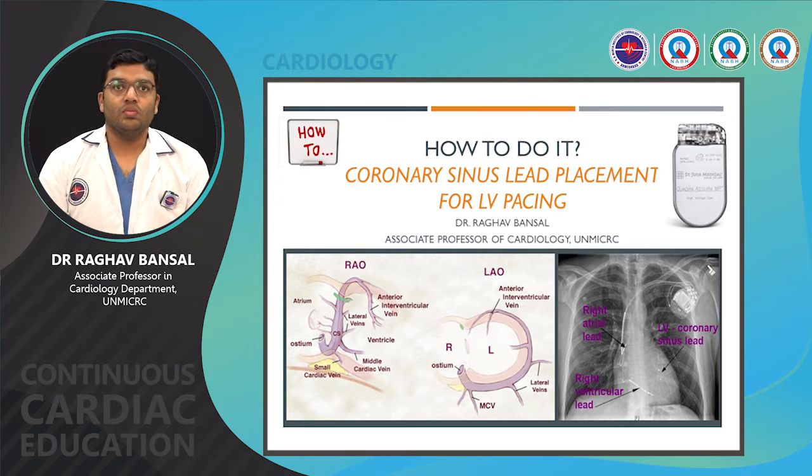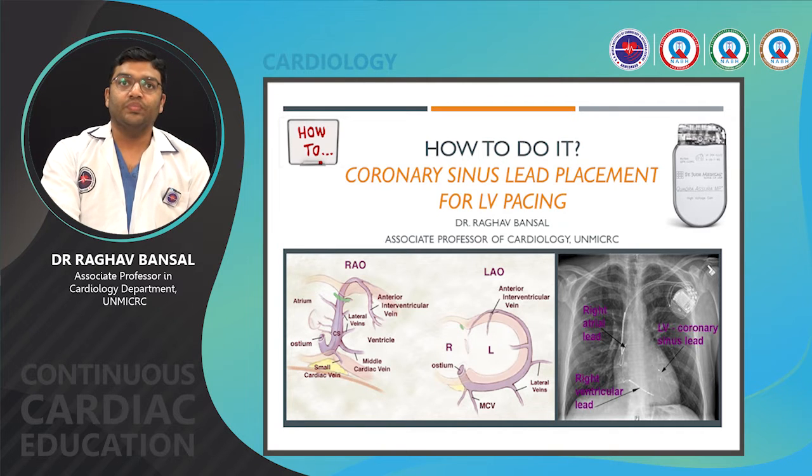Today we are going to talk about how to implant a coronary sinus lead during a CRT implant. This is a primer for the fellows who are beginning their careers and starting to implant a lot of CIED devices and are intimidated by CS lead implantation while doing a CRT.